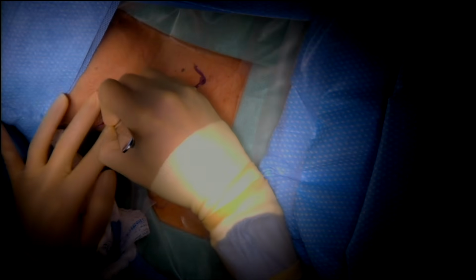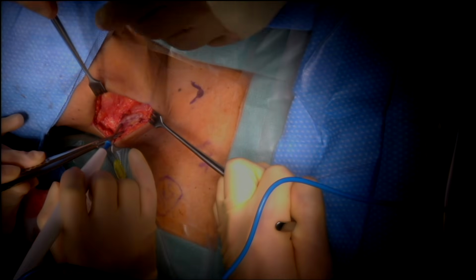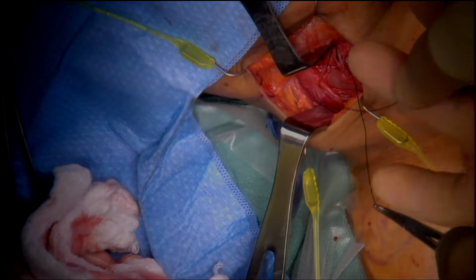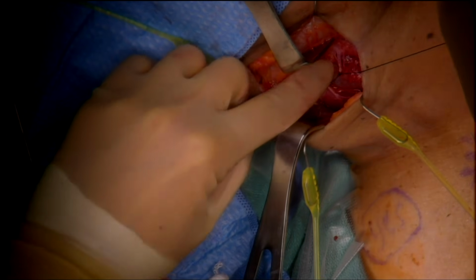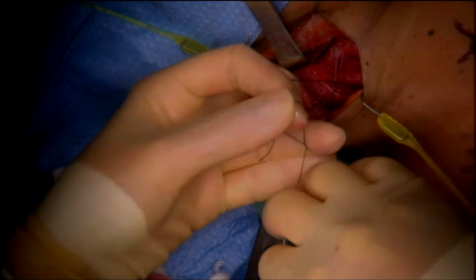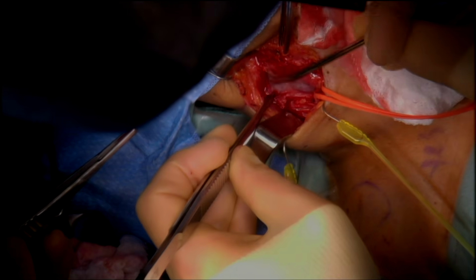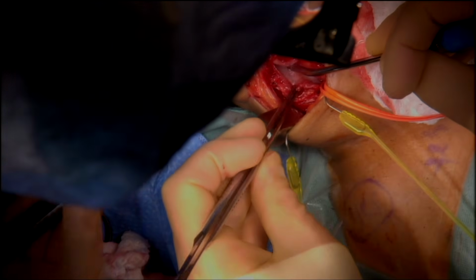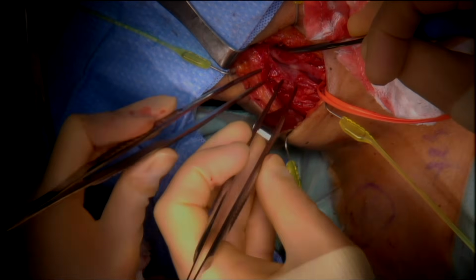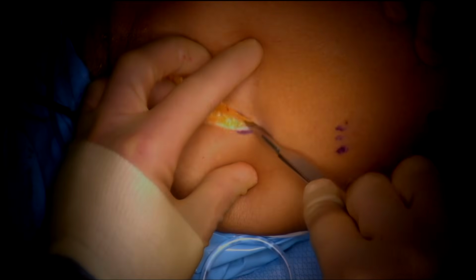So the right carotid sheath was exposed through an oblique incision across the anterior border of the sternocleidomastoid muscle, and the inflammatory phlegmon was identified and completely dissected off the vessels so that the surgeon could obtain control of the bifurcation. Since the carotid wall was in direct contact with the pus and also appeared fairly compromised, the decision was made to replace the affected carotid portion with a graft from the great saphenous vein.